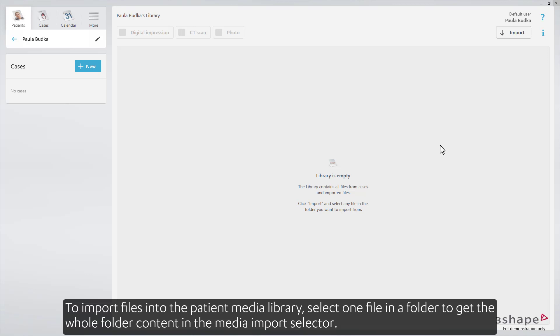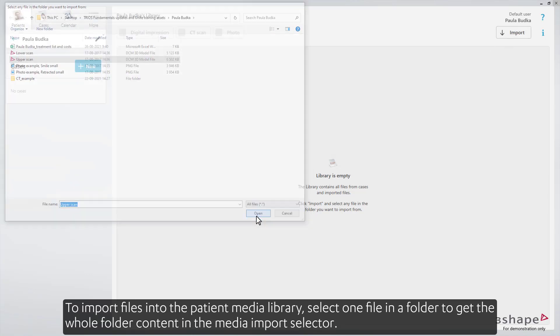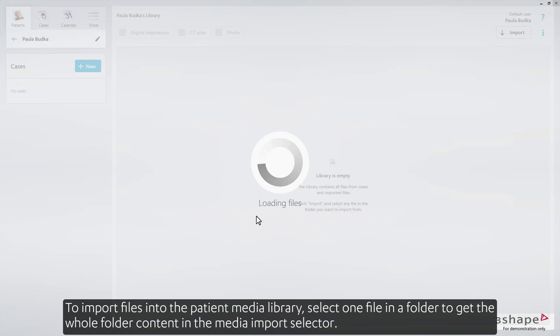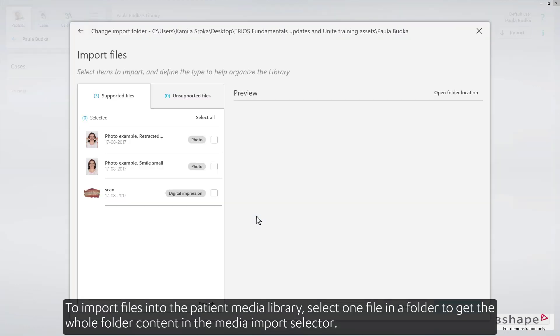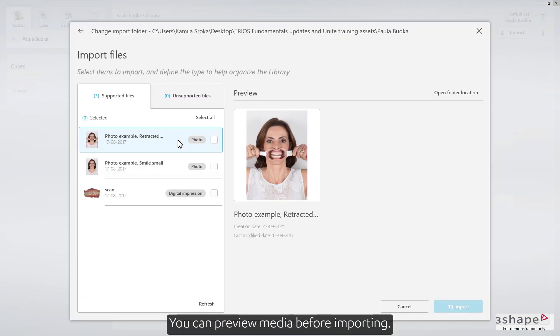To import files into the patient media library, select one file in a folder to get the whole folder content in the media import selector. You can preview media before importing.